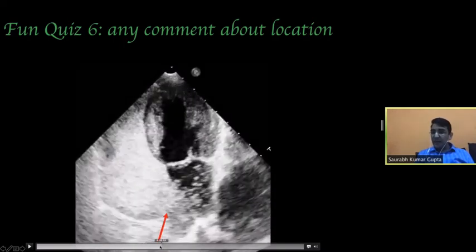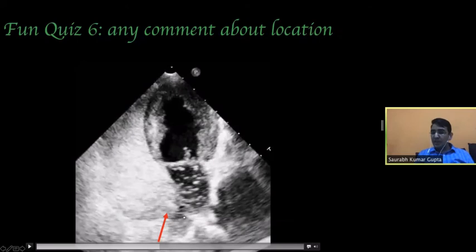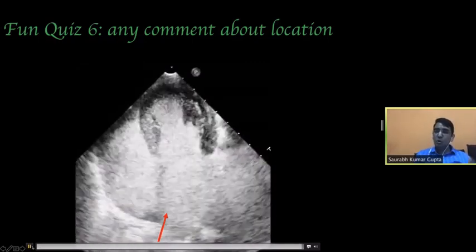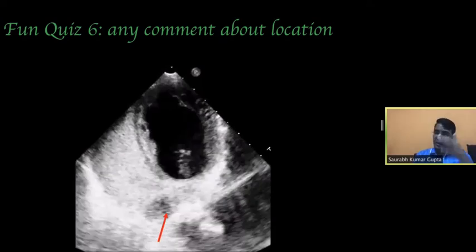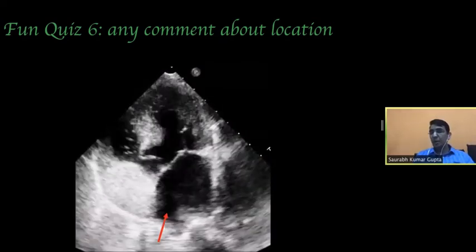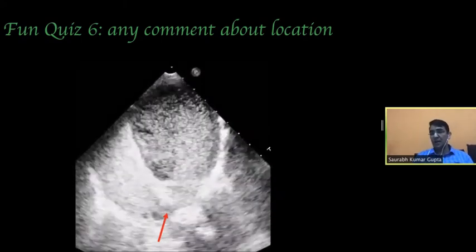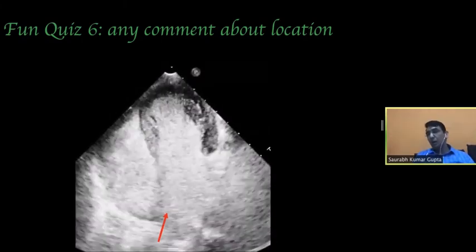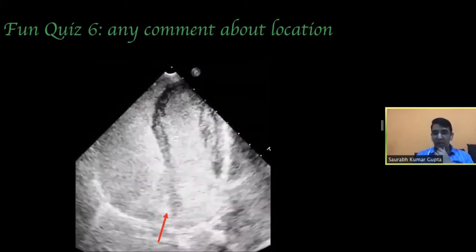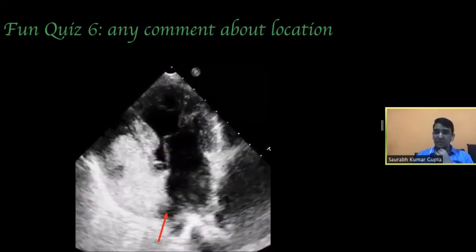And I think you all can appreciate that it starts from here. So in a way, it localizes the pulmonary arteriovenous malformation to the lung lobe. So this patient actually turned out to have a right lower lobe malformation, and then it becomes easy for us to save some contrast, save one imaging modality on CT, and while doing DSA and embolization of these malformations.